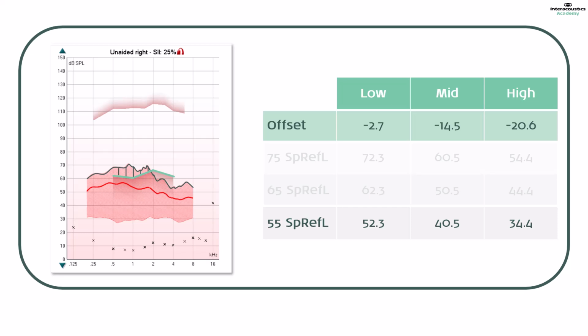However, there is an argument that it can be beneficial to perform the aided cortical test for all patients with mild losses, to ensure aided access to speech sounds is being provided via their device, to demonstrate that the occlusive elements of the ear mold are not obscuring sounds from being detected, and to ensure that the low gain provided by the hearing aids is sufficient.